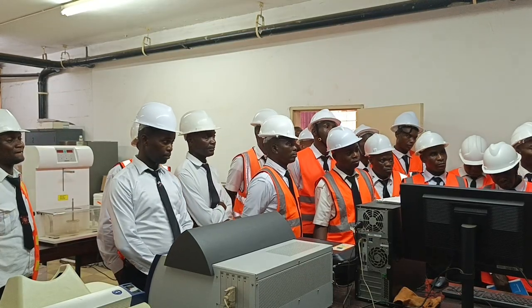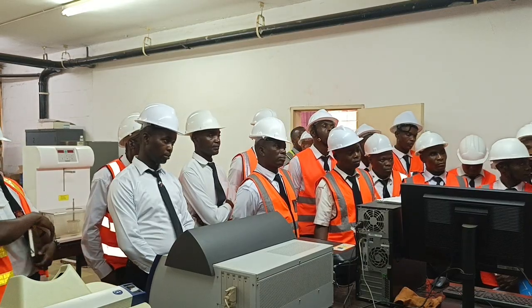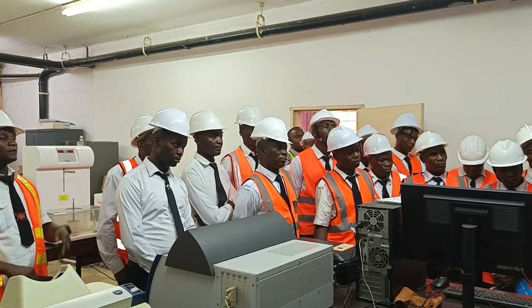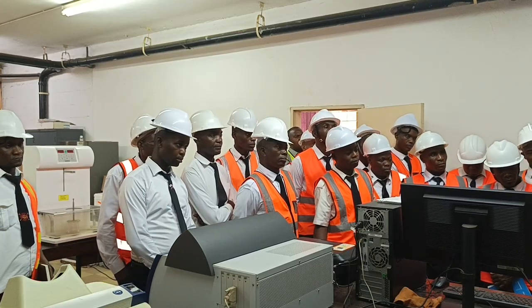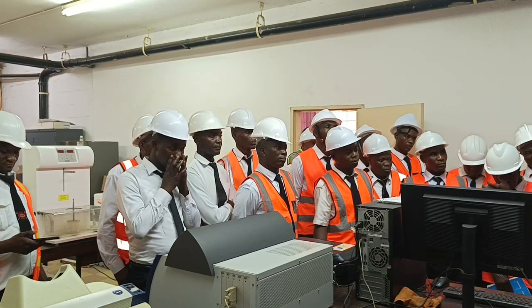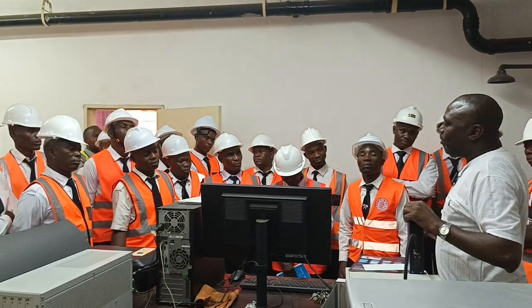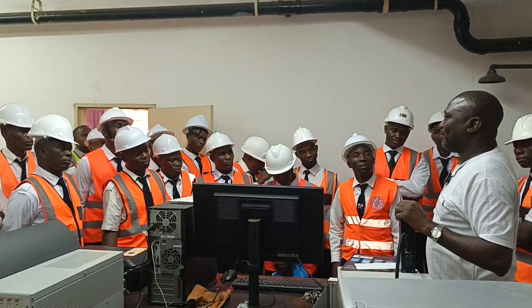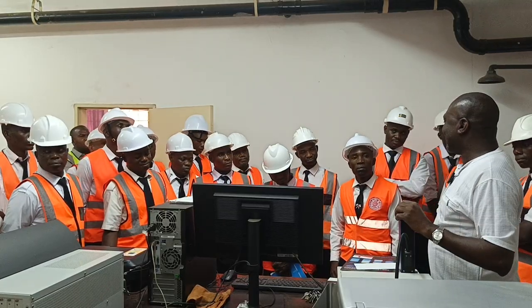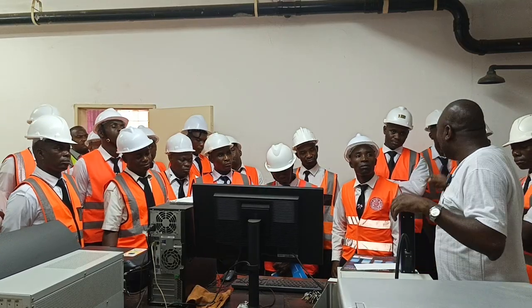And how you get your sample from the field or from the accident scene or from the fire scene is very important. What are you using to take your sample? Because if I go with you into the courtroom, you have accused me, I will be asking questions. Who got the sample? What did you use to get the sample? Maybe the sample was already contaminated. How did you store the sample? How did you transport it?